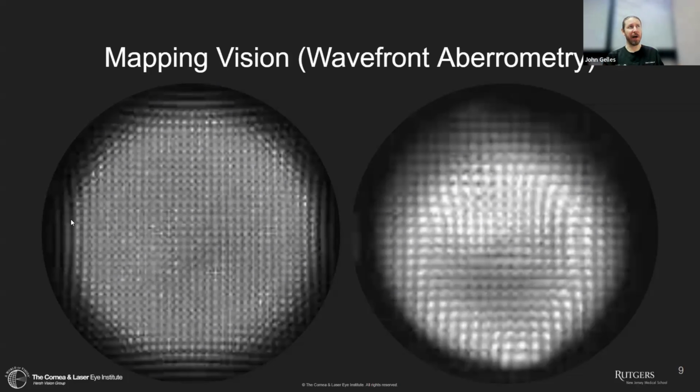You can see on the normal eye, those spots are relatively homogeneous. The points are about the same size, they have about the same spacing, and about the same clarity all the way through the central portion here, whereas you see the variability in the keratoconic eye. Some of these points are in focus, some of them are blurry, some of them are out of focus, some of them are spaced out, some of them are squished together, all of those sorts of factors. Think of that as almost like the raw images from a placido in a way, right? It's just looking at the raw sensor images.